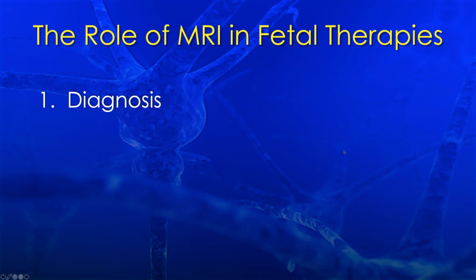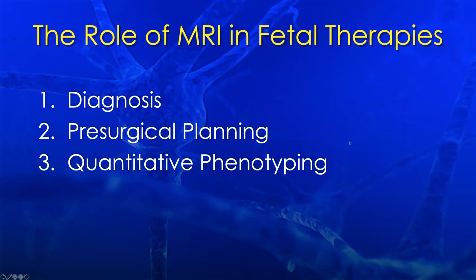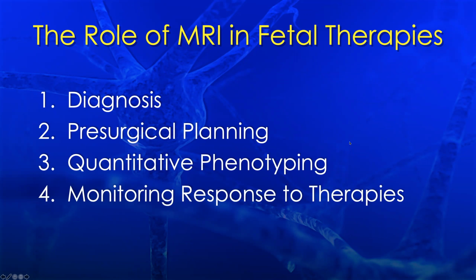So the role of MRI in fetal therapies is quite clear that qualitatively MRI plays a major role in diagnosis, but it also can be used for pre-surgical planning, quantitative phenotyping, and monitoring response to therapies.